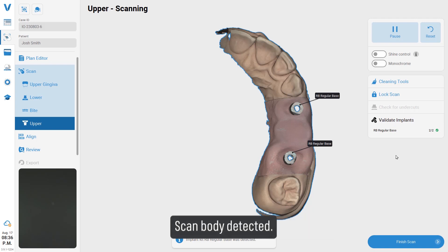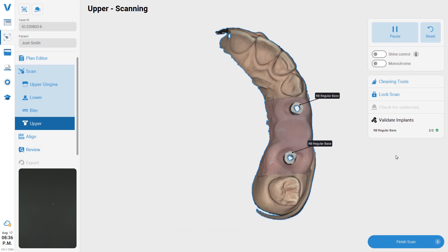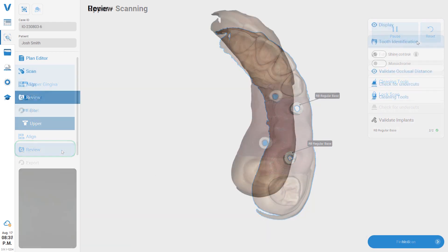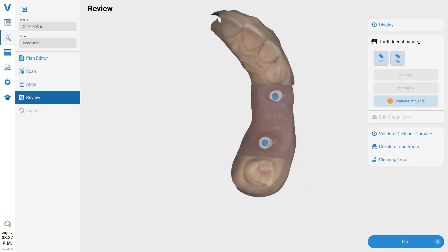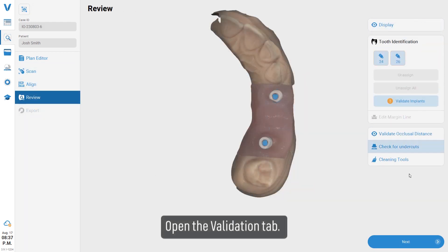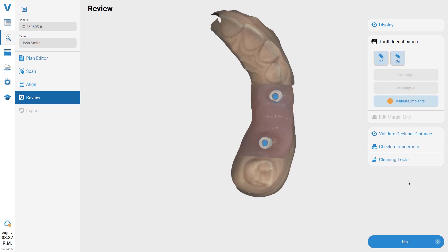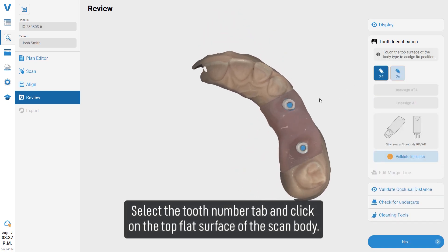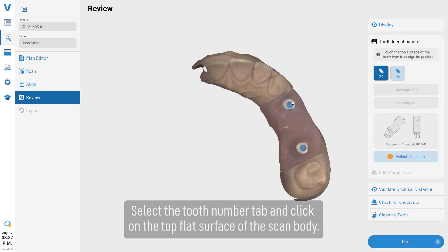Scan body detected. The validation step can also be done in the review screen. Open the Validation tab.